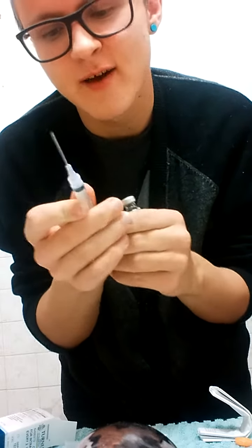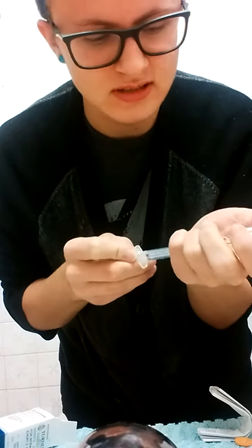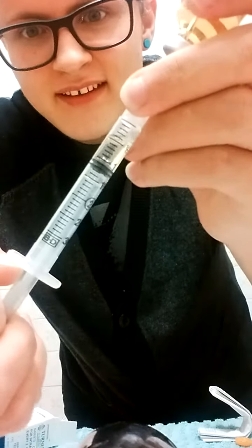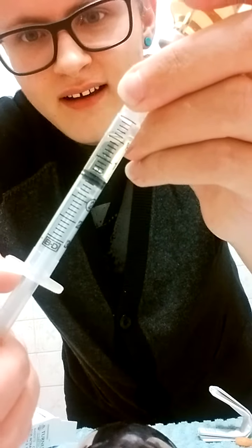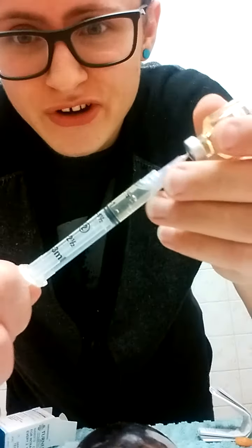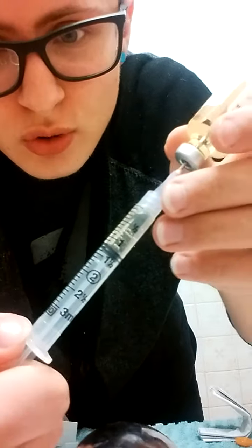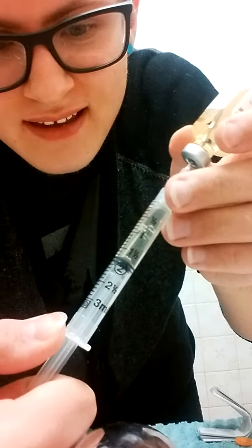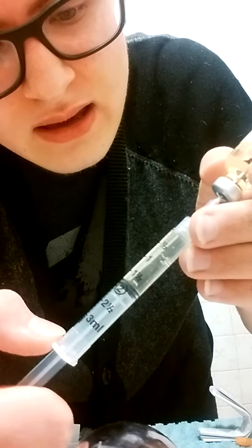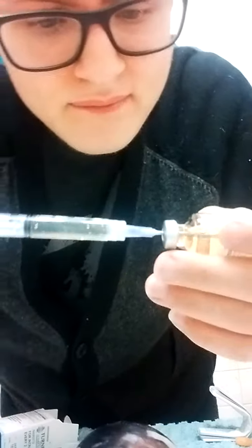The needle does it pretty much, and then you pull the thing back. It's like 1 in the morning — I'm doing this at like 2:30 when I get my shot. I take 2. See, it's at 2 — the plunger has to be at the tube.